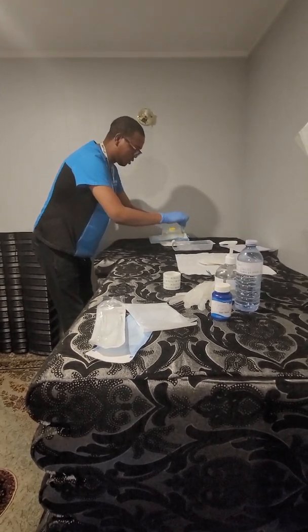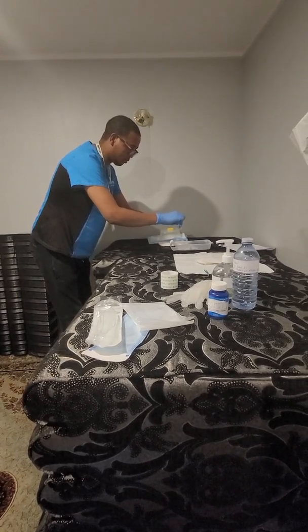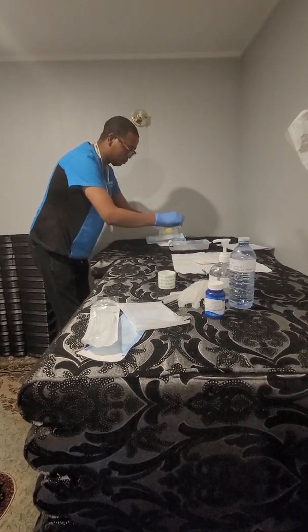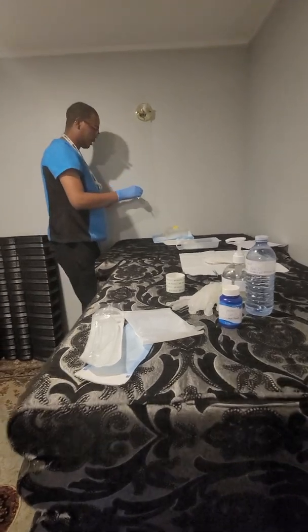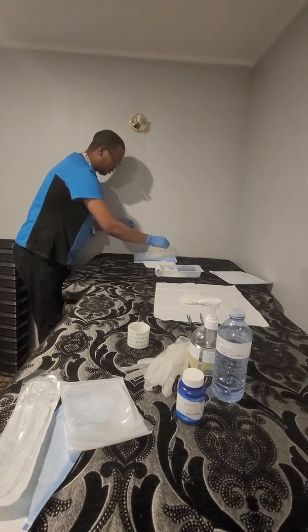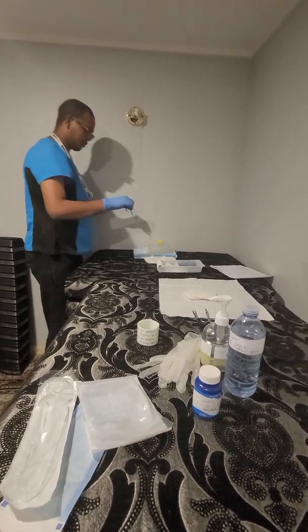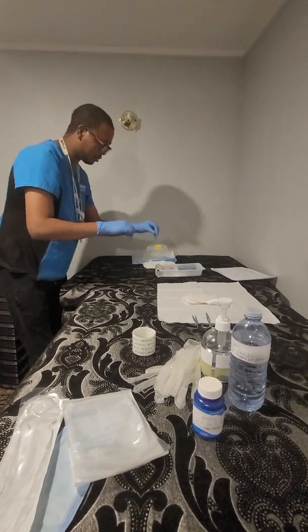Squeeze it. Okay, clean the periwound, nearest one. Toss it. Second.